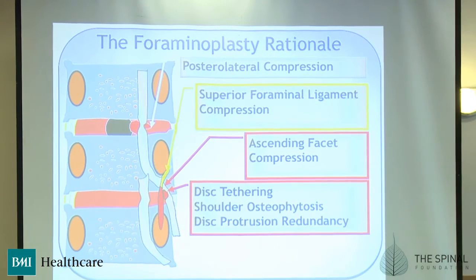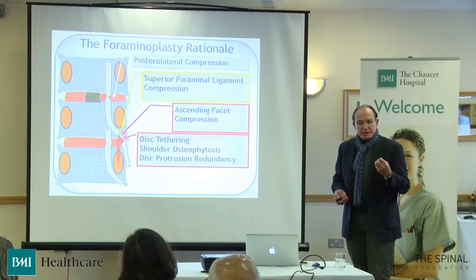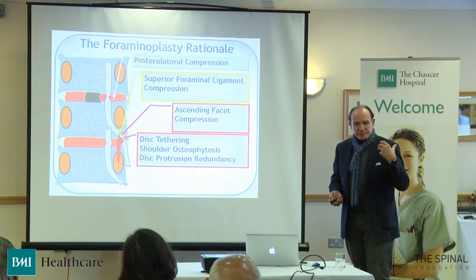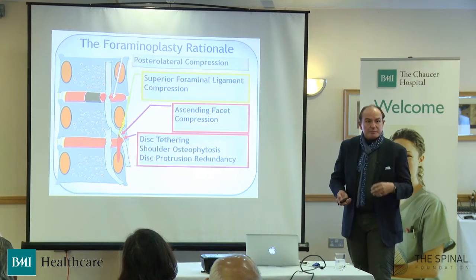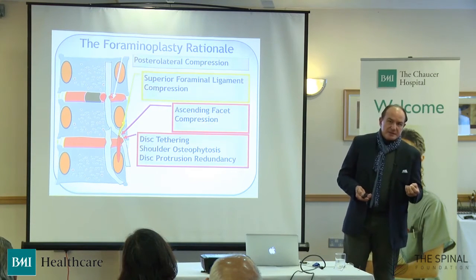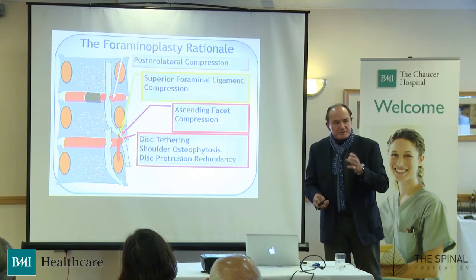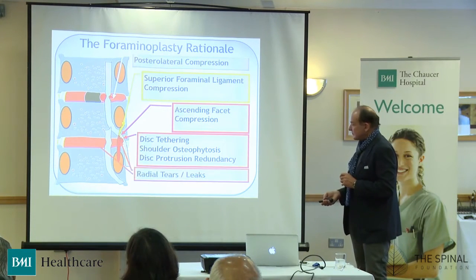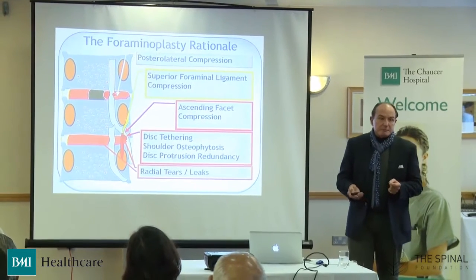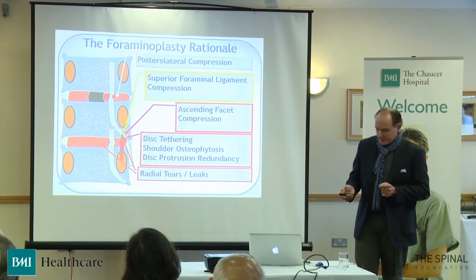They're very difficult to see on the CT scan or MRI scan. But when you're in there and you mobilize the nerve, you can feel the little spike of bone sitting in the front of the nerve. Why it occurs, I don't really know. It's partly because the disc weakens particularly at the posterolateral angles, pulls on the bone at that level and produces very small osteophytes. And it may be aggravated by the effect of the facet joint beginning to push into that area via the nerve. And the whole lot may be augmented by the presence of a leaking disc or high-intensity zone.